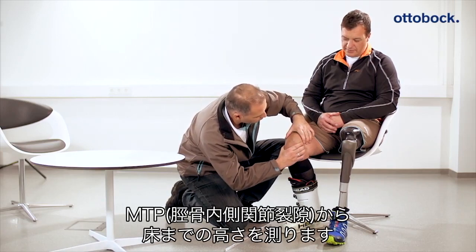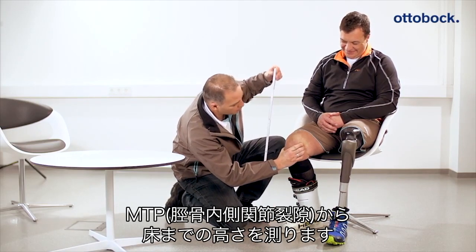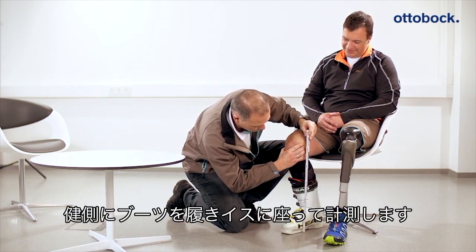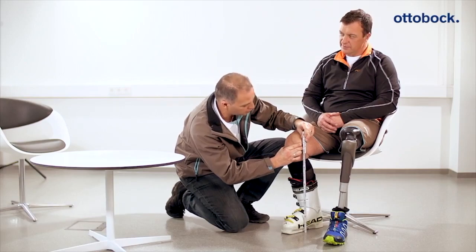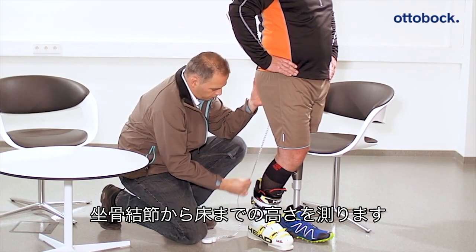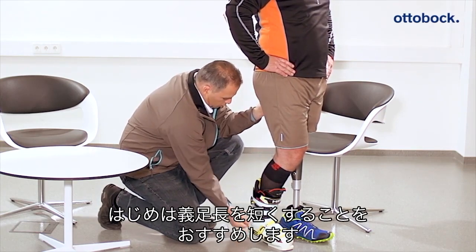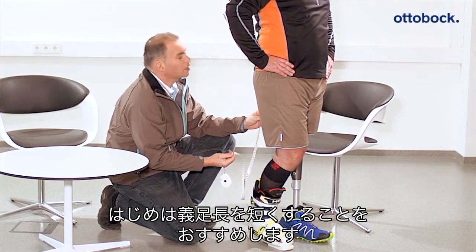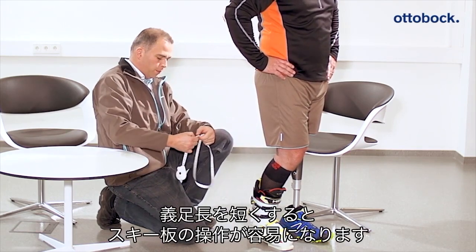The correct medial tibial plateau to floor measurement for the patient should be determined on the intact side with ski boots on, while the patient is sitting. The ischial tuberosity to ground distance of the user should also be measured with the ski boot on. It is advisable to reduce the prosthesis length by 3 to 5 cm at the beginning so as to have better control while skiing.